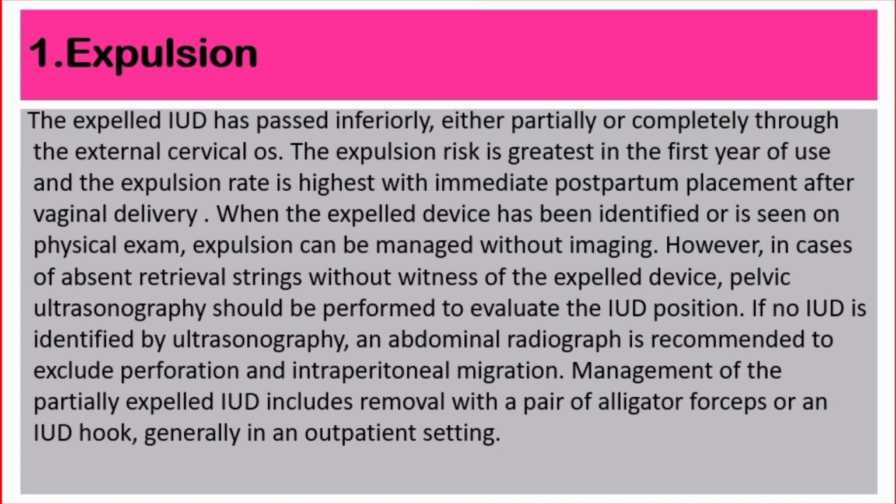If no IUD is identified by ultrasonography, an abdominal radiograph is recommended to exclude perforation and intraperitoneal migration. Management of partially expelled IUD includes removal with a pair of alligator forceps or an IUD hook, generally in an outpatient setting.